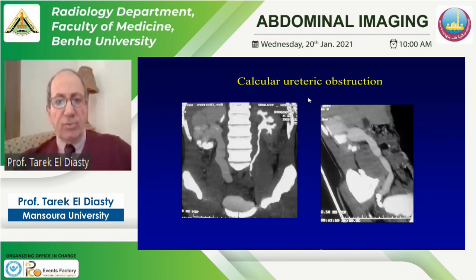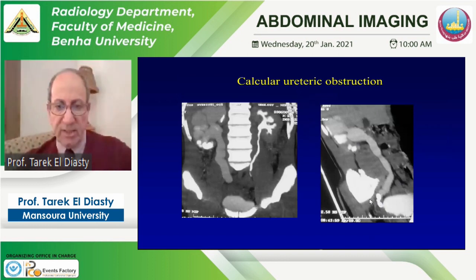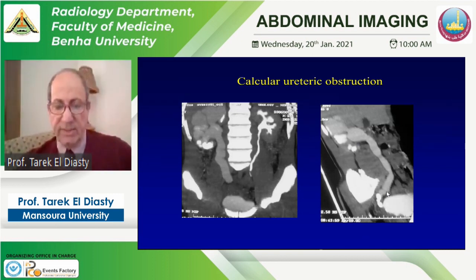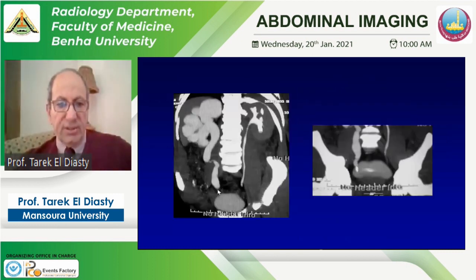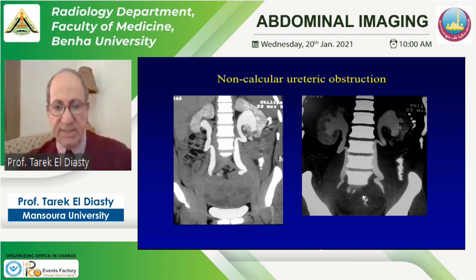In hydronephrosis due to calcular obstruction, CT can assess lower caliceal stones and lower ureteric stones using different reformatted images, determining whether stones are obstructing or if there is a ureteric stricture proximal or distal to the stone. In cases of non-calcular ureteric obstruction, CT urography can show a large pelvic mass displacing the bladder and obstructing both ureters — in this case, a sarcoma with calcification.